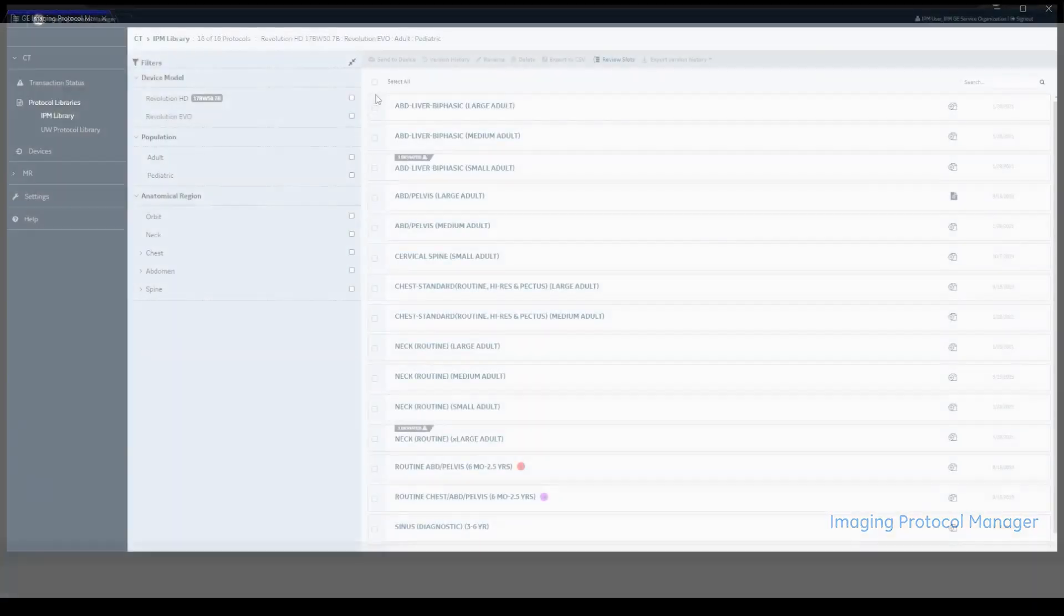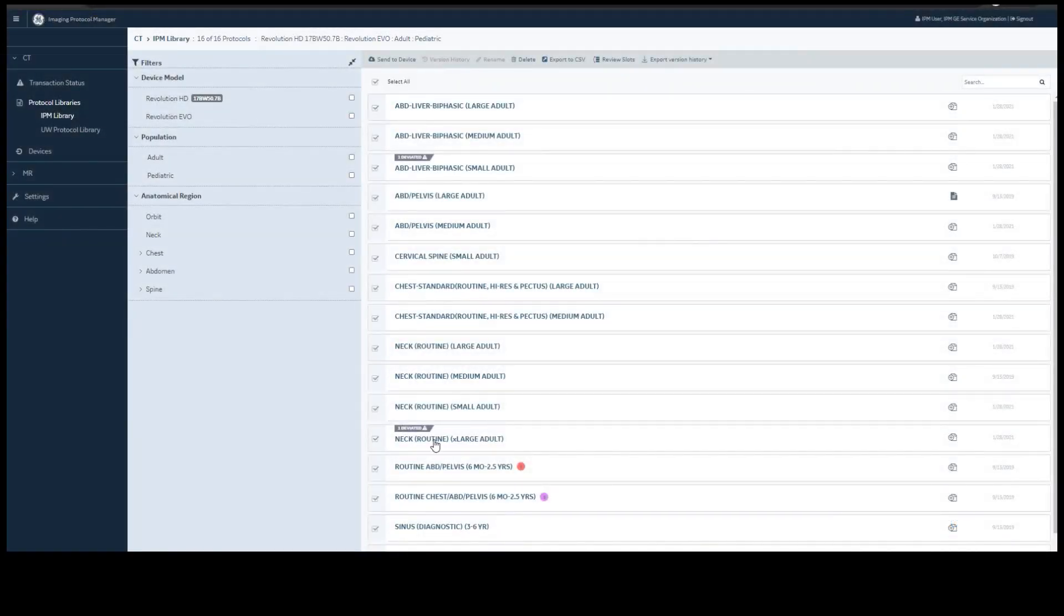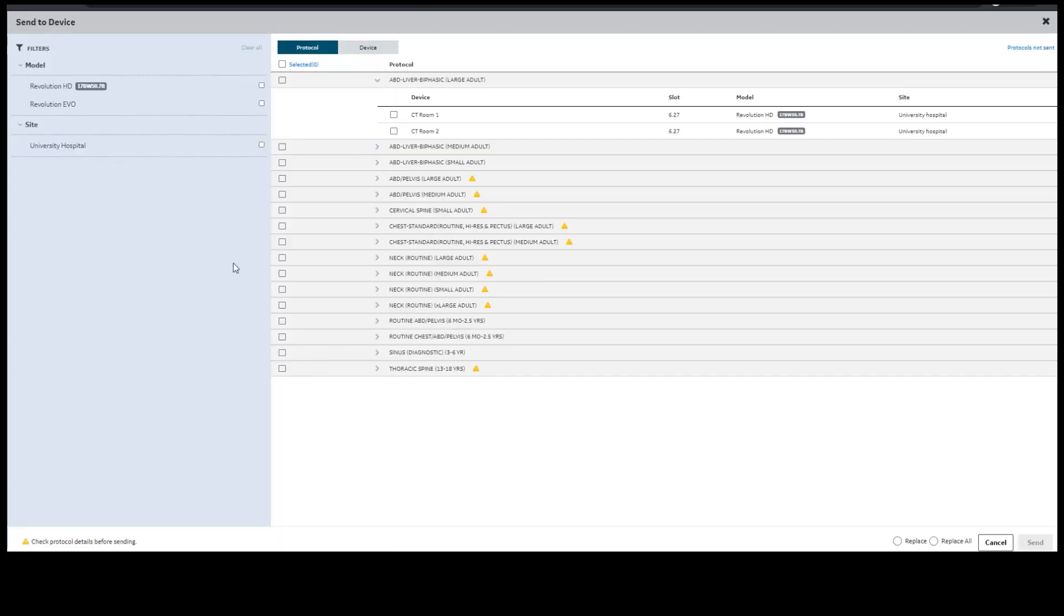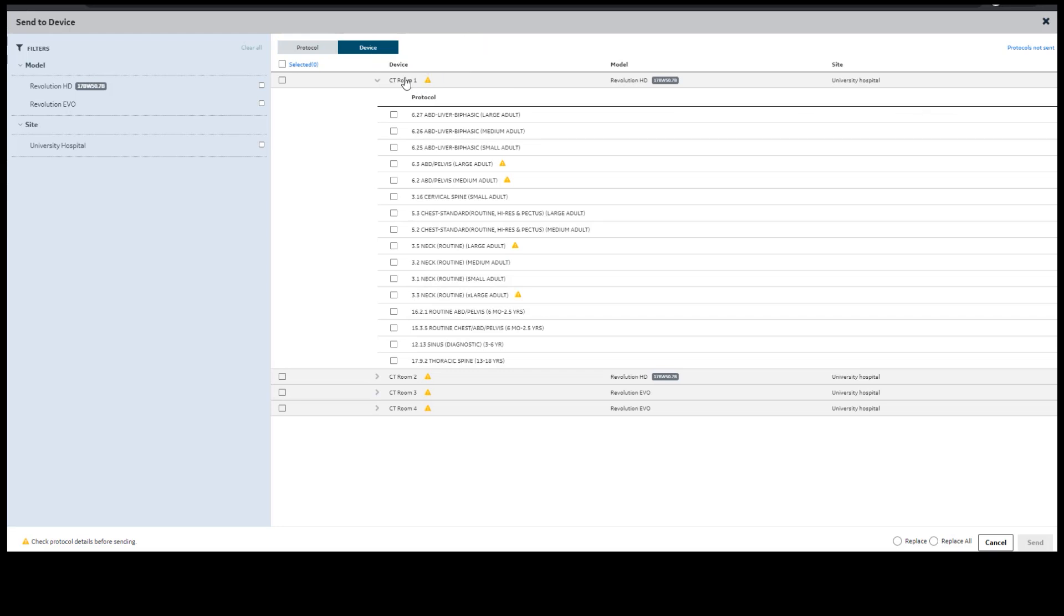You have the option to select all or choose as many individual protocols as you would like to send to a device. This screen can be looked at in two different ways. You can view by protocol, the name of the protocol with the room and the slot number and the model underneath it, or you can view by device with the room, the model, and all the protocols within it.